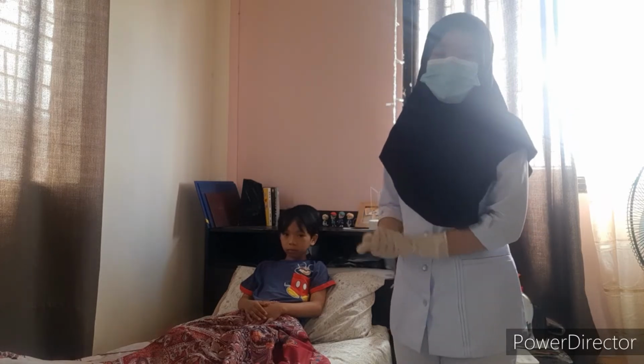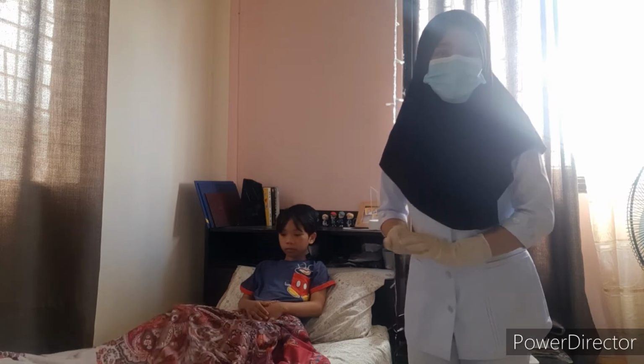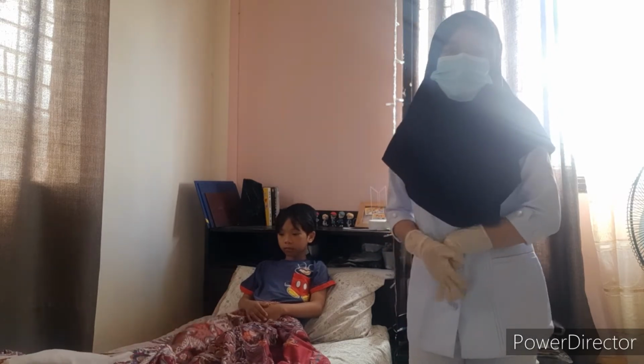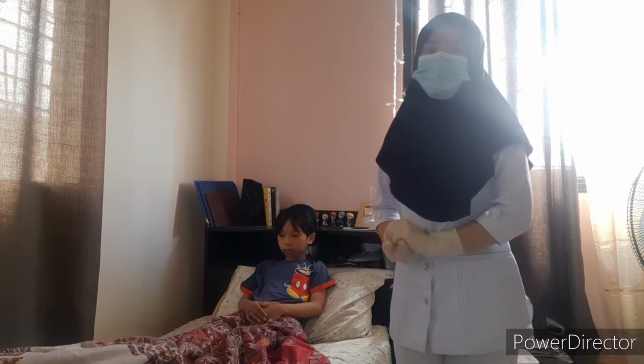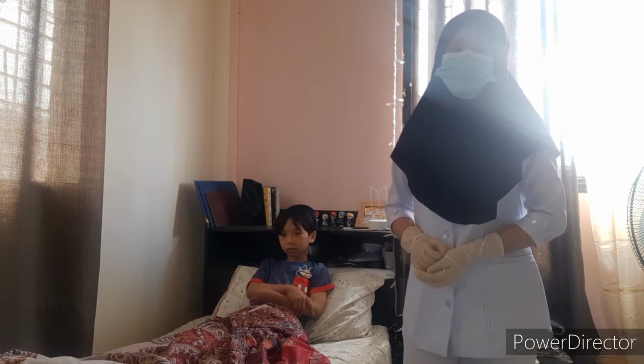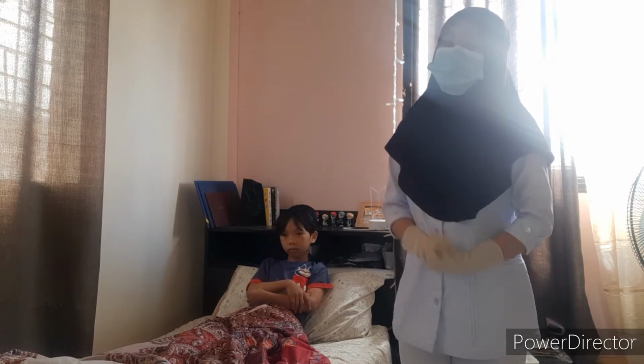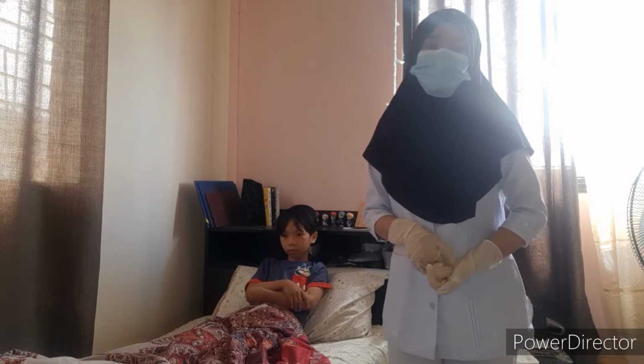Using the digital thermometer orally, ask the client if he or she has taken hot or cold liquids or has smoked. Then if yes, wait for 20 to 30 minutes after smoking or eating or drinking hot or cold liquid before taking an oral reading. So this is to make sure that the temperature reading is accurate.